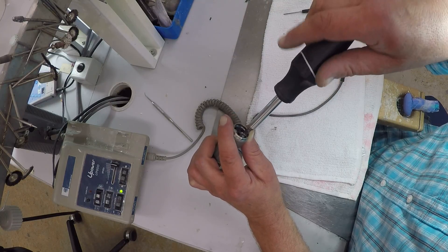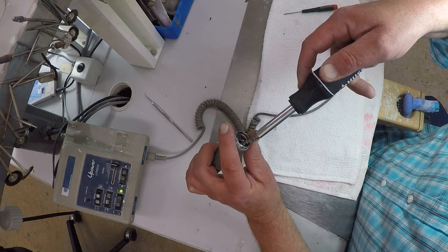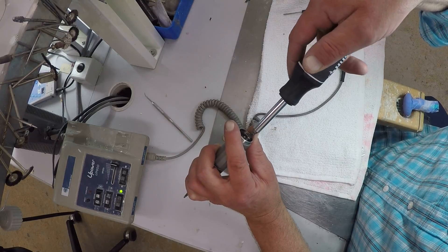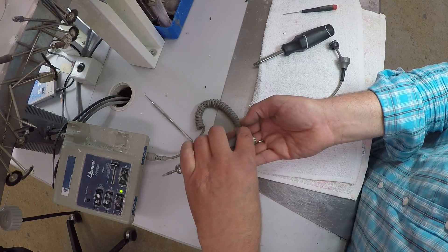It's not like a typical brush that you normally see. This is a carbon brush. It has something to do with the electrical output inside the motor.